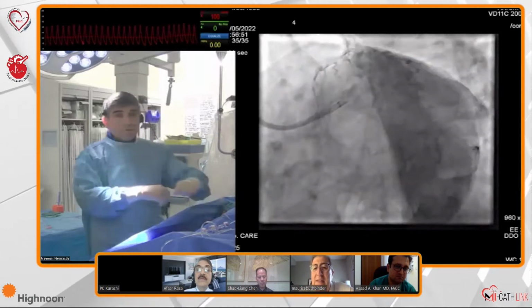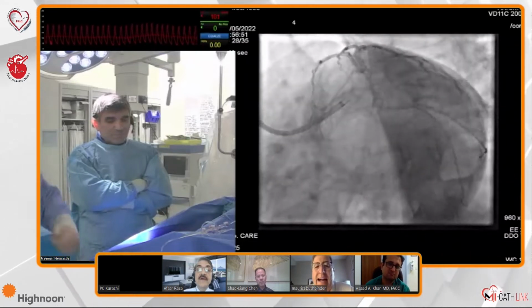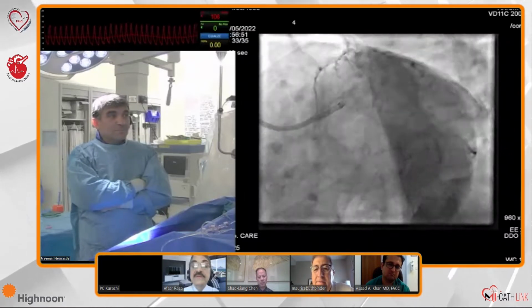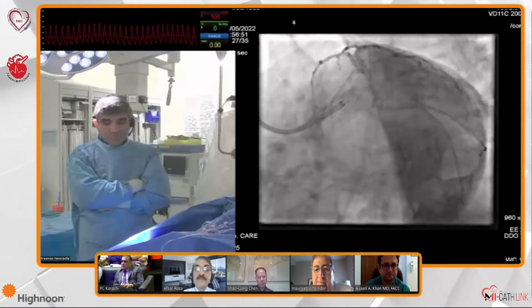Yeah, I think ostial ramus might do cutting balloon and then stent circ and LAD. Exactly. One stent strategy, I'm not sure. I won't jail that LAD. I'll probably do a 2-stent strategy. Yes. Okay, let's see. Nadeem, can you hear? If we can have your comments, please.